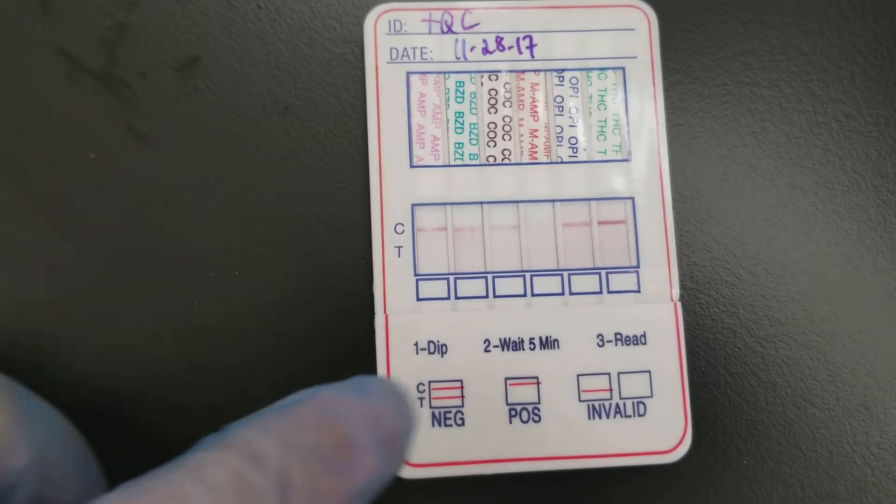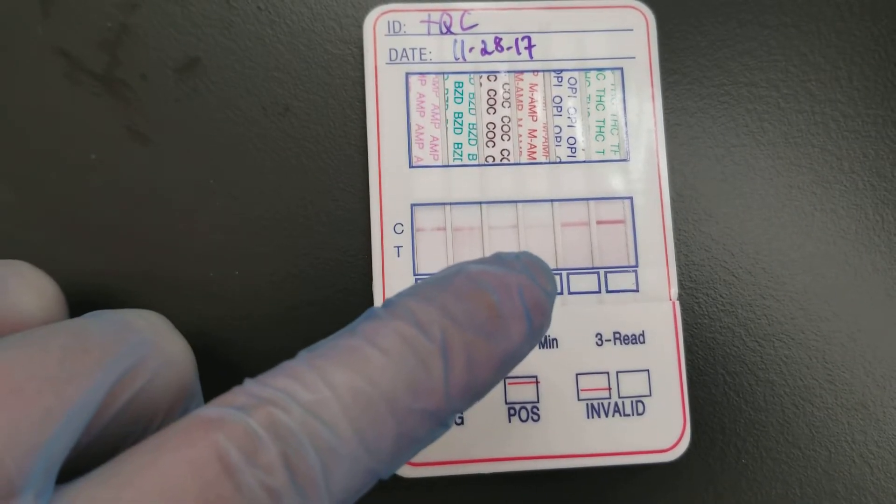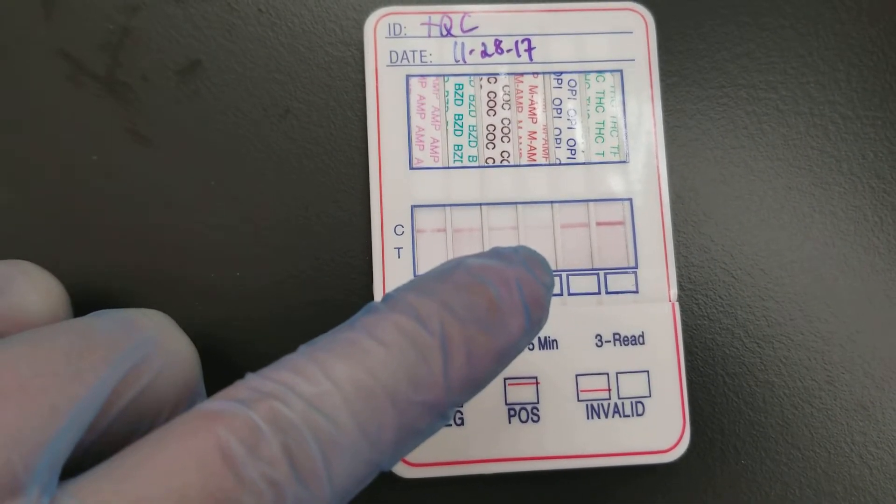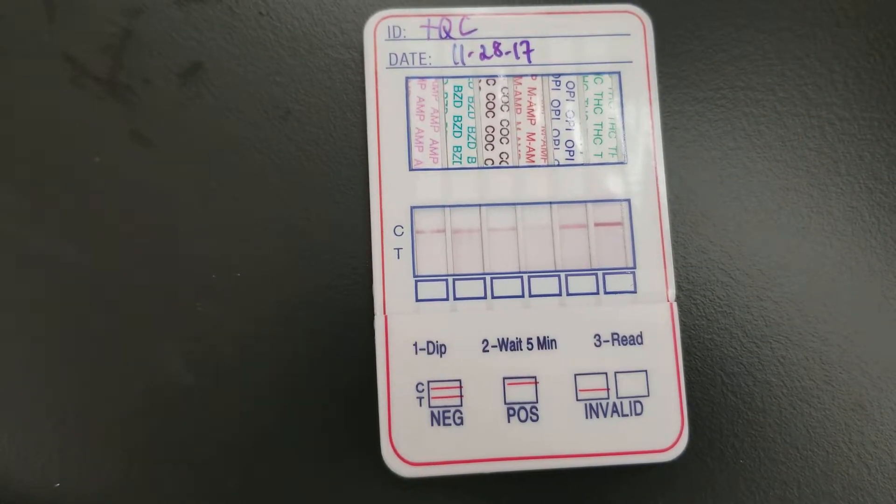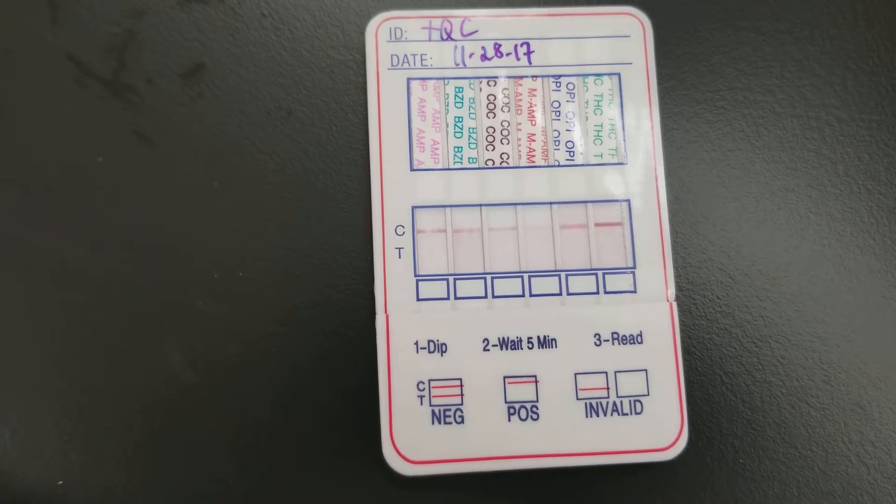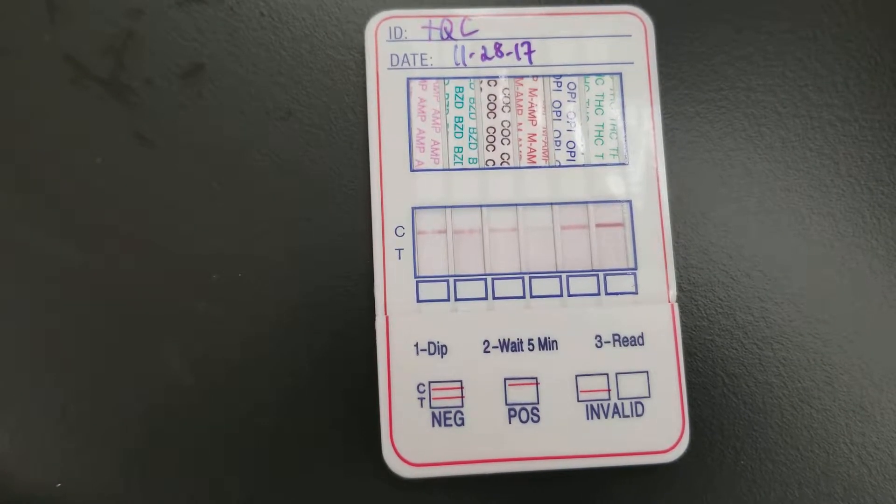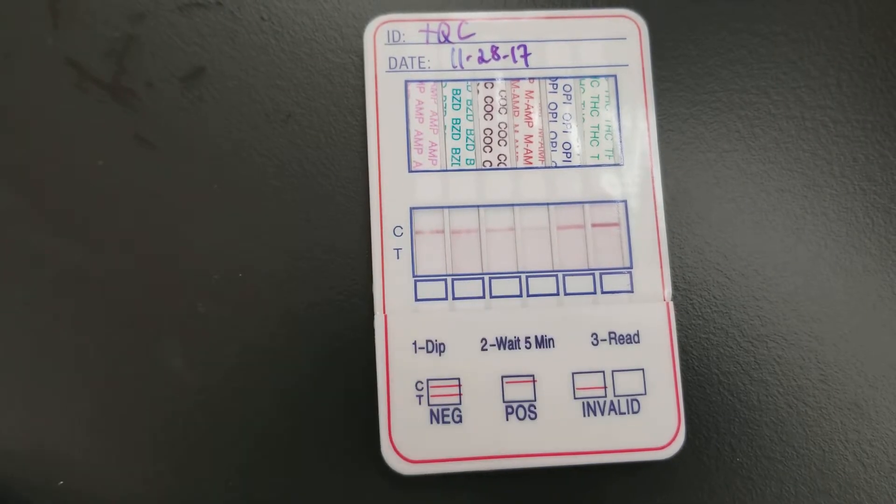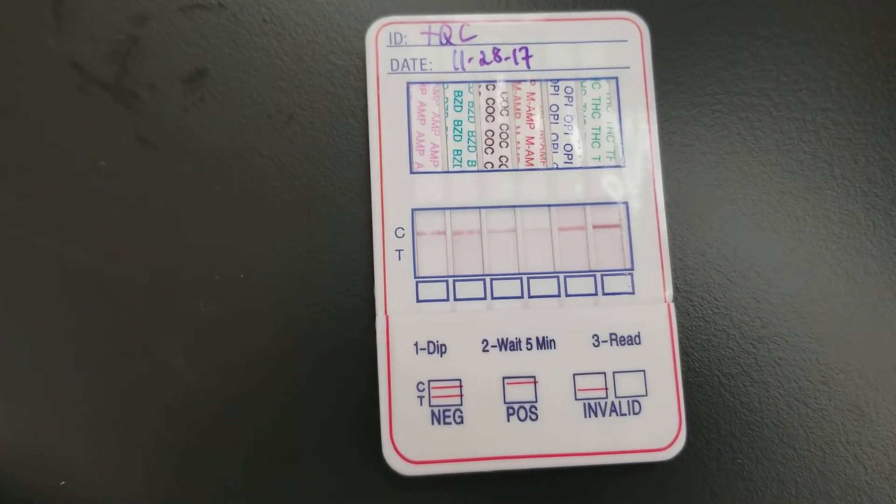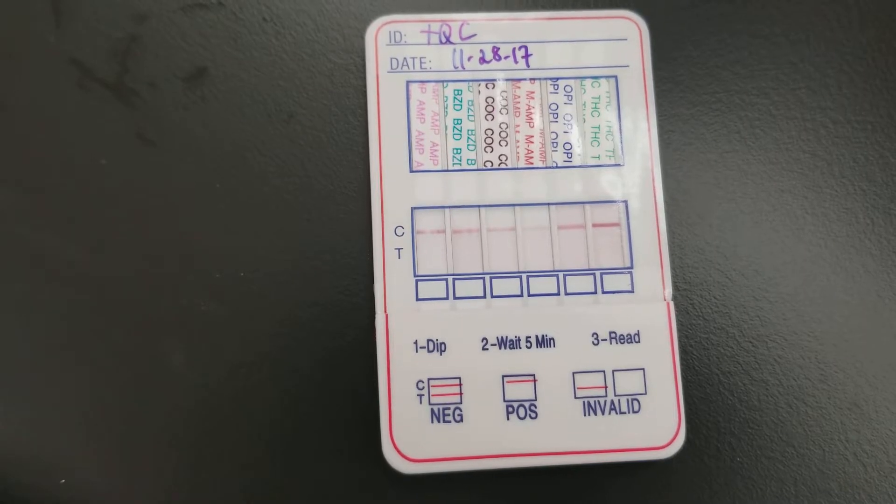See the fourth one over, the amphetamine methamphetamine, is going to be positive. It has a faint line right now, but when you can see a faint line like that, it still means that the line is present. So in that case, it would be positive.